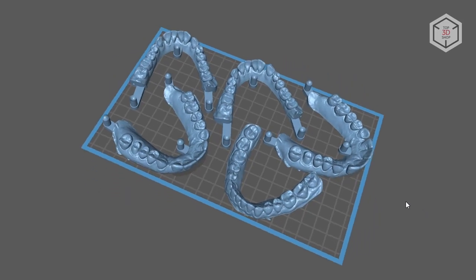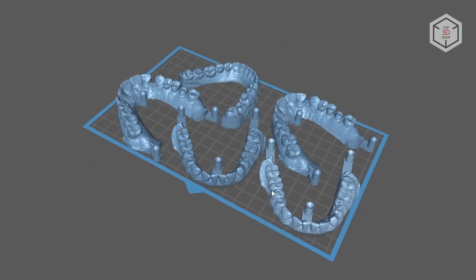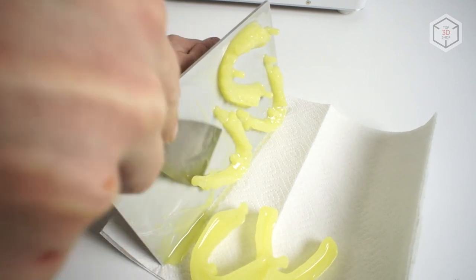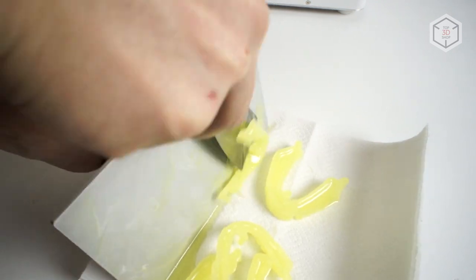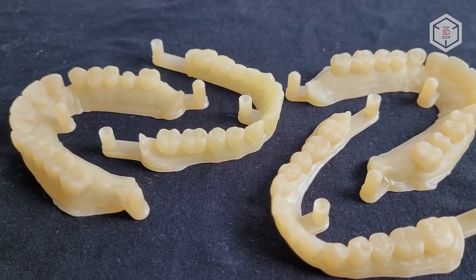In the third run with Model Ortho Resin, we printed out 5 teeth master models, 2 upper and 3 lower jaws. They were oriented to cover the entirety of the print surface with no supports. This was aimed to check the uniformity of the screen's lighting on the whole printing area, and no problems occurred. After post-curing, we got these results.